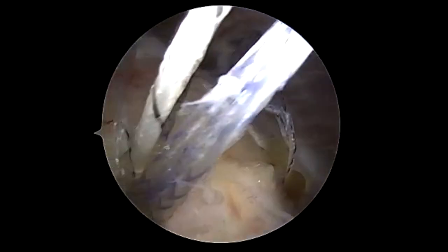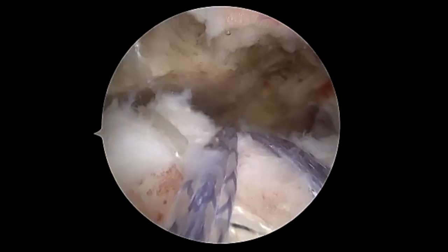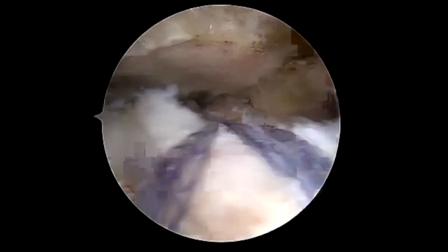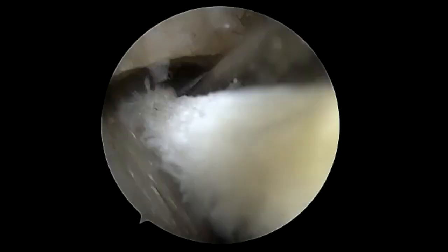We've placed the double row ready for this rotator cuff repair, and these are knotless anchors which we pull on either side out of the anterior and posterior portals to get them out of the way. Then through the cannula we're going to place the one millimeter thick patch.